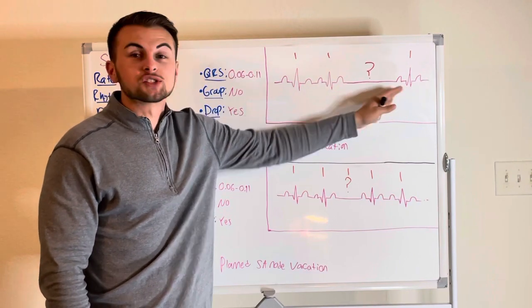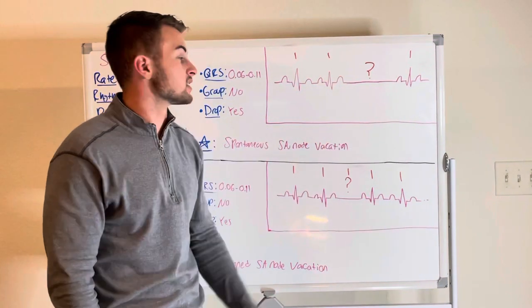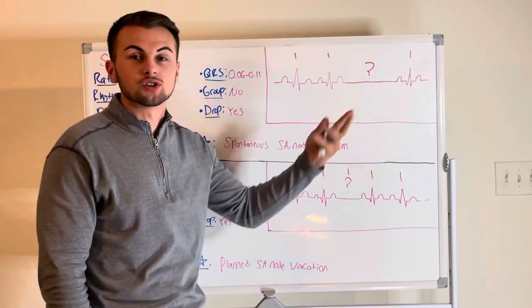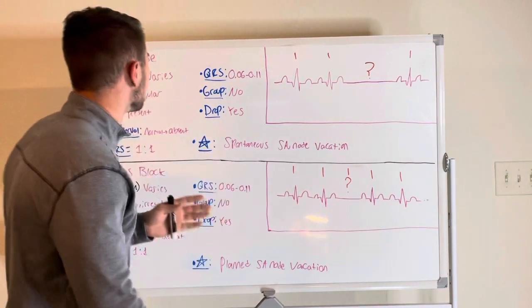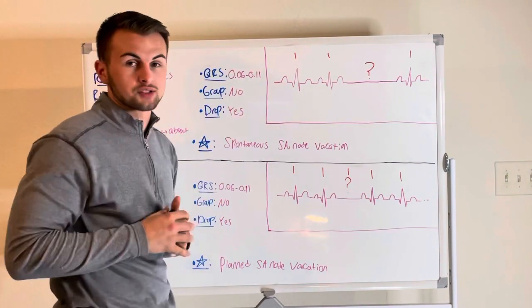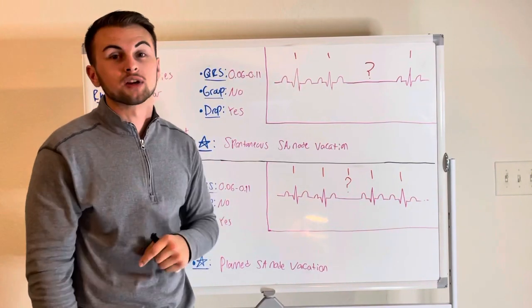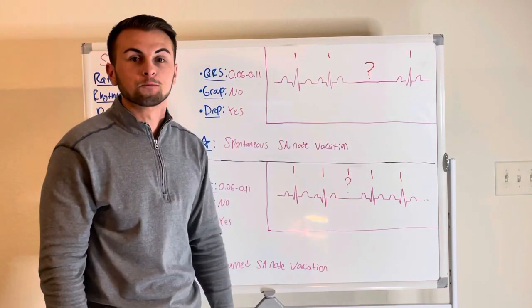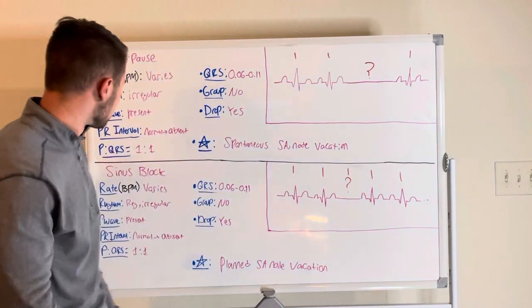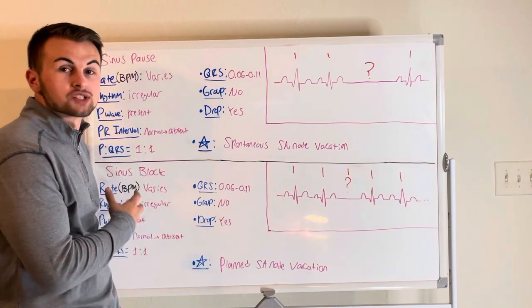So when there's a very long pause between complexes, we sometimes say that this is sinus arrest, although there is no defined diagnostic criteria to determine sinus pause versus sinus arrest. So just remember that DJ Sinus Pause will unpredictably drop a beat on us, but he will always pick it back up again.